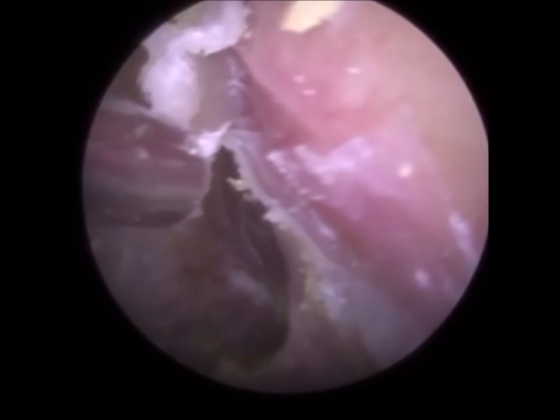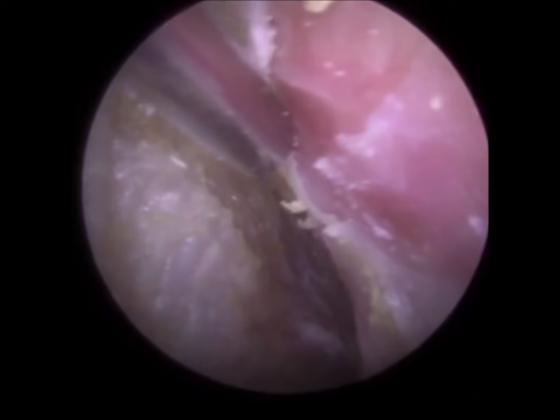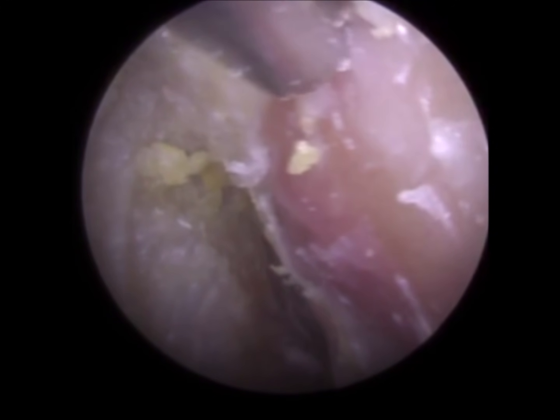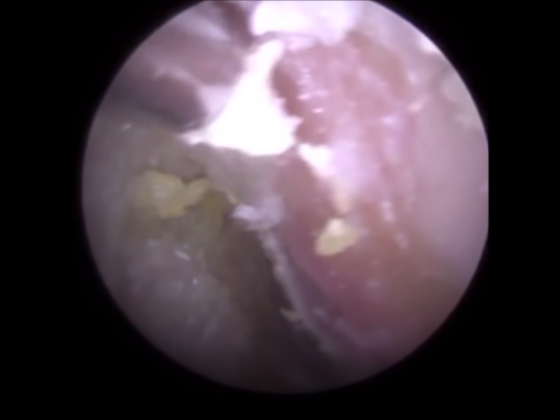And I didn't want to put any drops in there, I didn't want to put any sodium bicarbonate because of these erosions. I don't know what's beyond these erosions. Any drops could penetrate. I know the patient's already been using drops because that's what we've been prescribed from the GP, but I didn't want to add any more because it could have some adverse effects because of the erosions. So just near the roof of his ear canal on the anterior canal walls at the front, just again peeling gently.